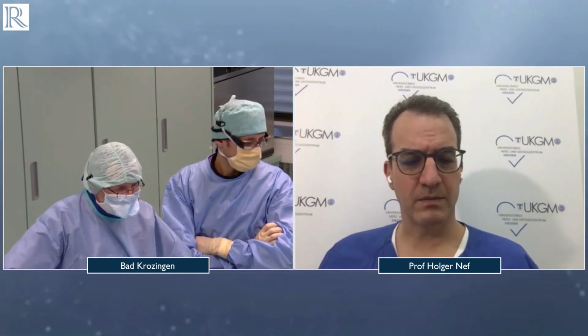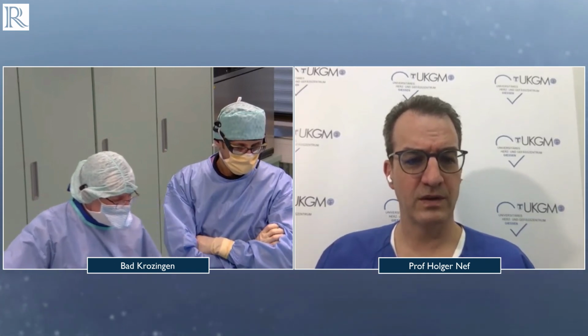So thank you, Marek. This makes it very clear. This brings us to the next question. What about bifurcations? Should we go directly upfront in bifurcation with the IVL, because we don't have this wire bias, and we don't have to exchange the wires?